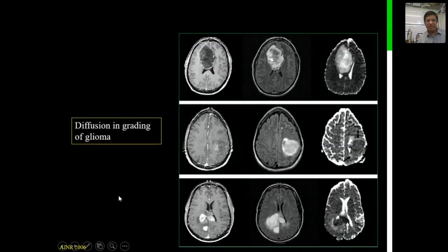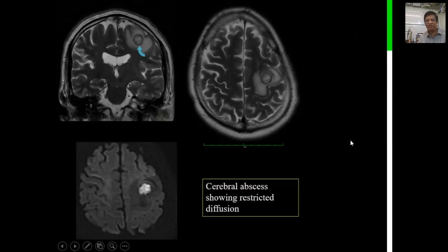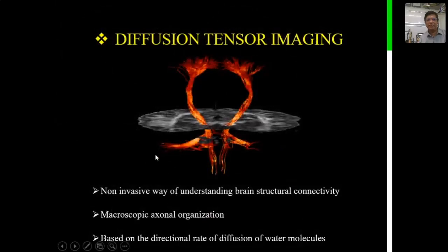Based on the same AJNR 2006 article, diffusivity can differentiate high-grade gliomas from low-grade gliomas. High-grade gliomas show marked restricted diffusion. Low-grade gliomas show facilitation of diffusion. Intermediate-grade gliomas show relatively less restricted diffusion. Abscesses show restricted diffusion in the center, whereas in a cystic tumor, the solid or peripheral component shows restricted diffusion.